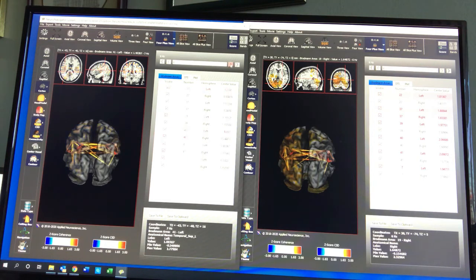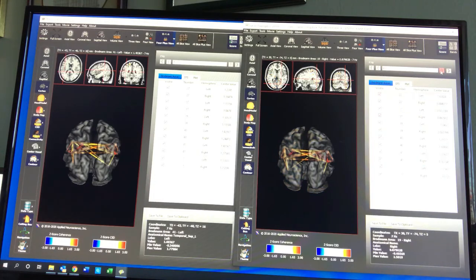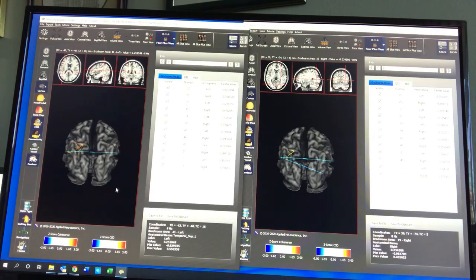So when we go up to 7 hertz, we still see the connectivity problem, but not as much of the abnormality in the frequencies being elevated too high. Just that the connectivity is much too high, or what we call overconnected, the inefficiency of the connectivity. So this is basically that case.